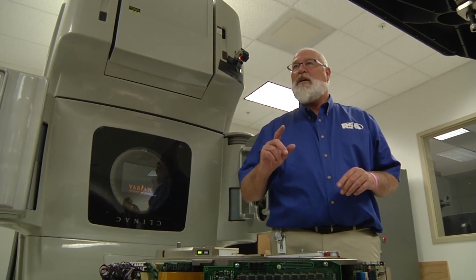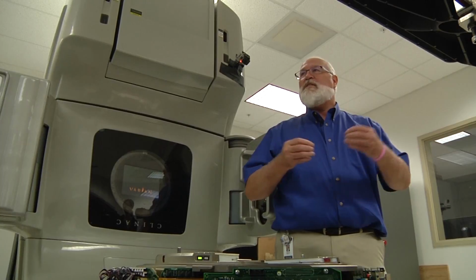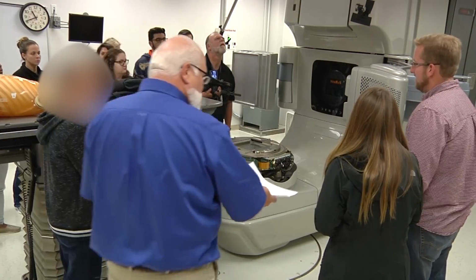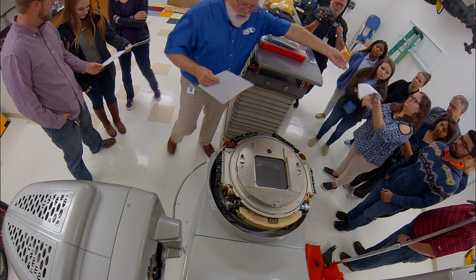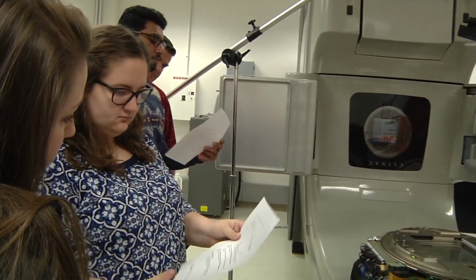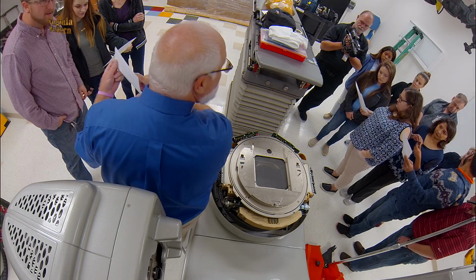I have a diagram that I'll pass out, a couple sheets, so you guys can see what the makeup of a leaf drive system is. You guys can share this one here. If you pass those around. So the components of the leaf system: you're going to have your leaf, you're going to have your drive screw.